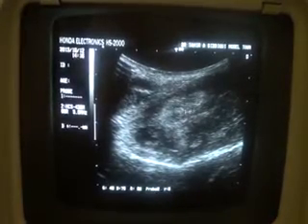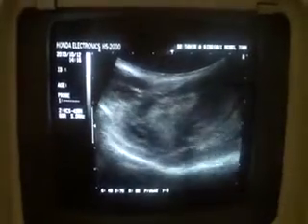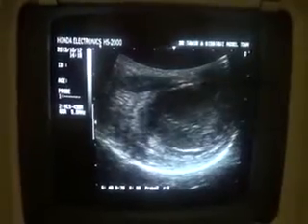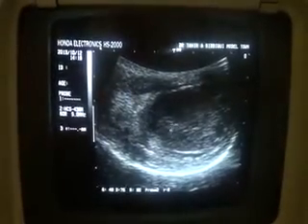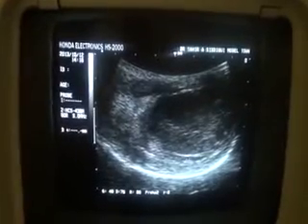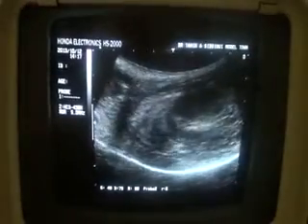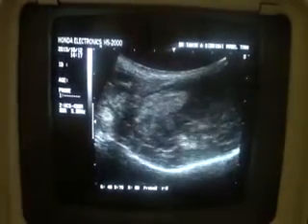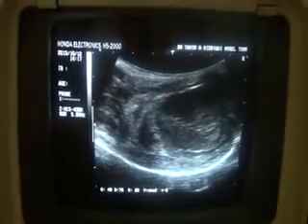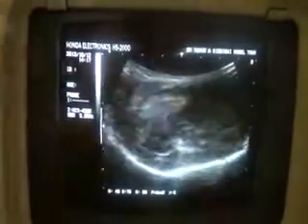This is the epididymis, a comma-shaped area, more echogenic than the adjacent testicular parenchyma. This is the testicular parenchyma, with a small amount of fluid posterior to it and a thick wall, and the epididymis appears more echogenic compared to the rest of the testis.